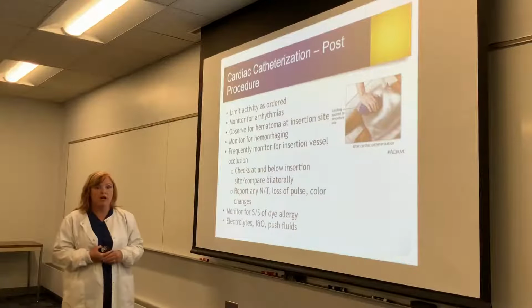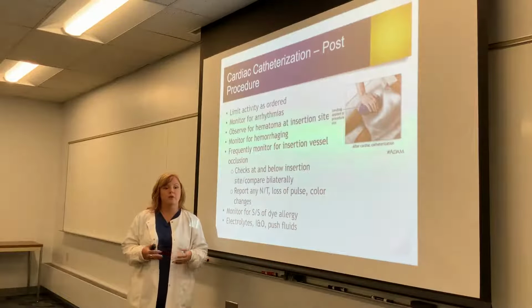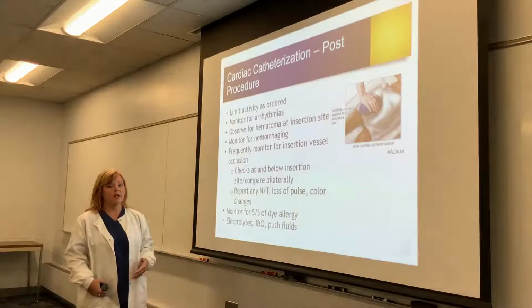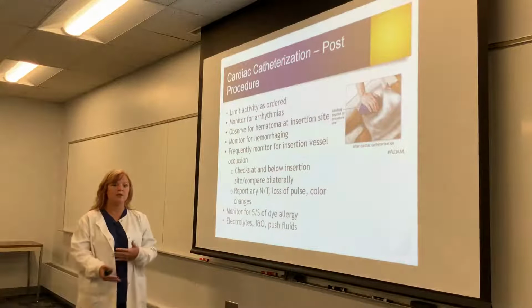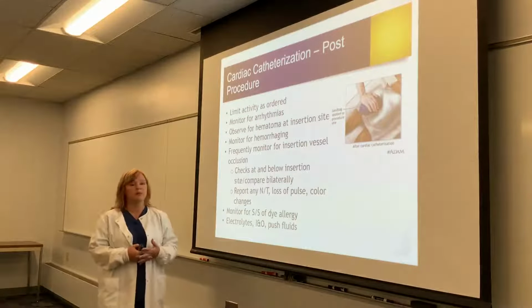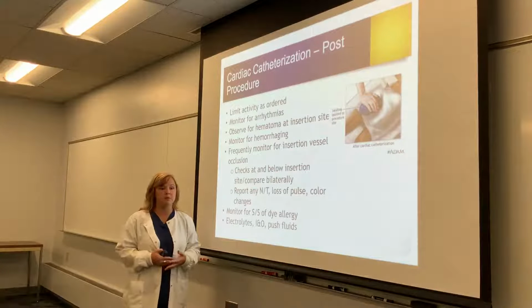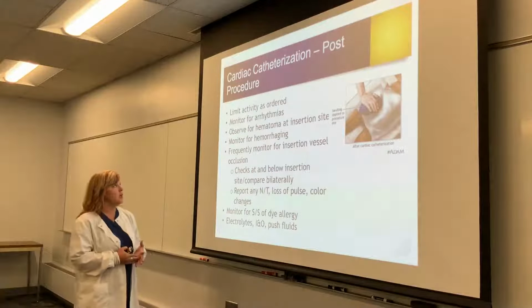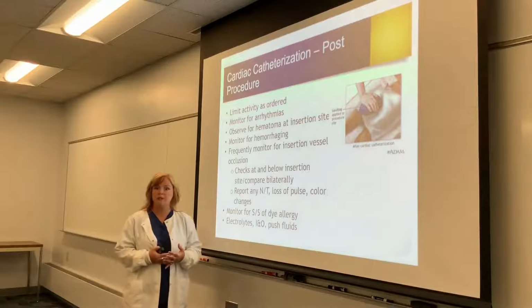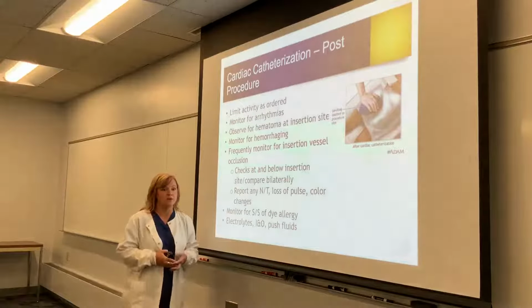So after the cardiac catheterization, they are going to have some type of bed rest. It's going to depend on how they closed the site and again, what site they use. So if they're using the radial or the brachial, your bed rest will be different, but if it's the femoral artery site, typically bed rest is anywhere from 4 to 6 hours, could be longer if they have any post-procedure complications. They will be on cardiac monitoring, so you'll be watching them for any dysrhythmias because we were manipulating inside the heart, they have that risk, so we're watching for that.